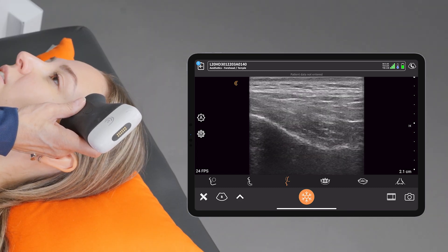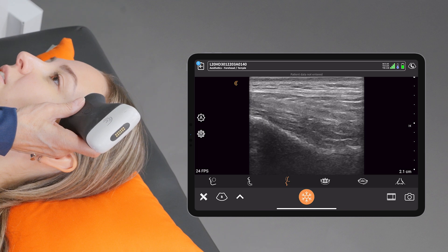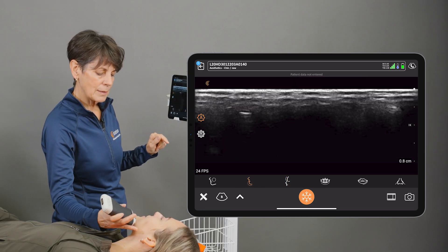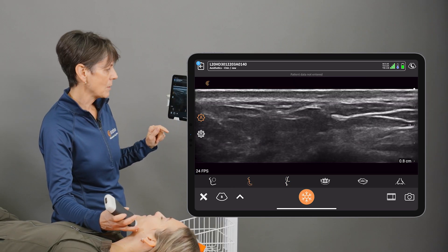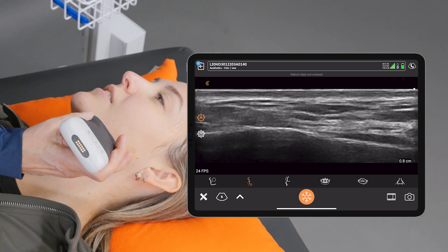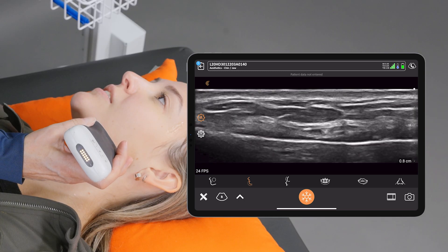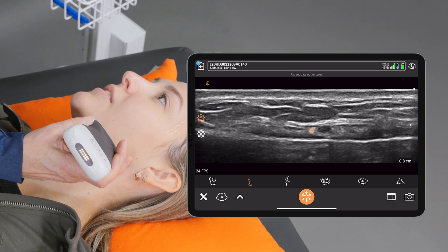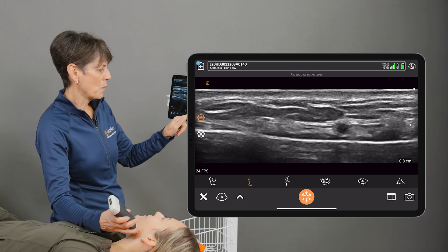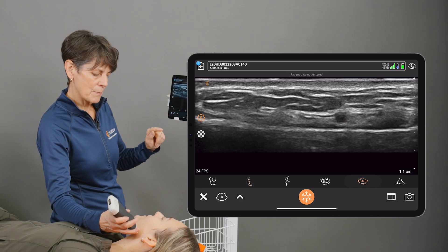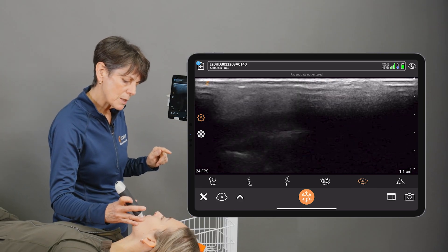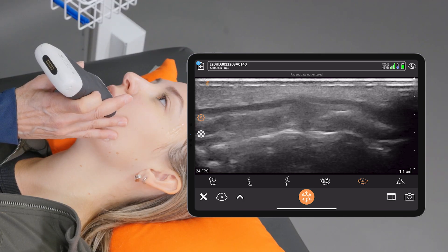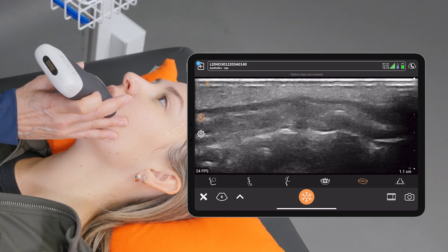If I want to switch to the jaw, I can just tap on the jaw icon, and then we can zip down to the jaw line here and image that nice facial artery. And if I want to do a quick switch over to the lips, we can just switch to the lip preset and image that nice orbicularis oris muscle.